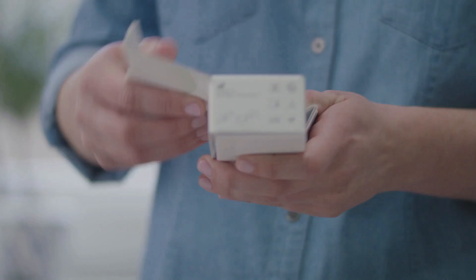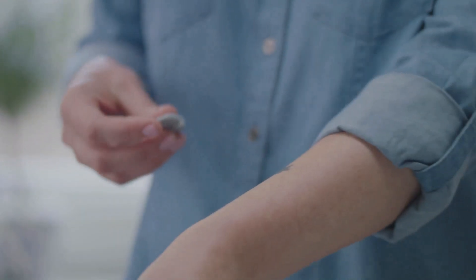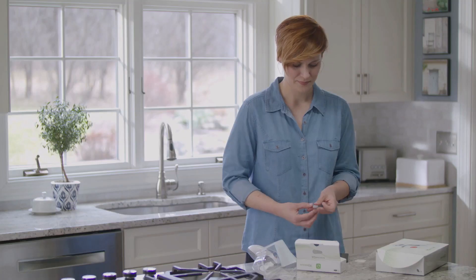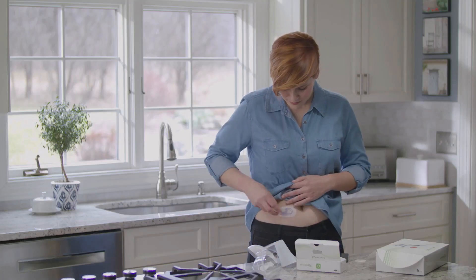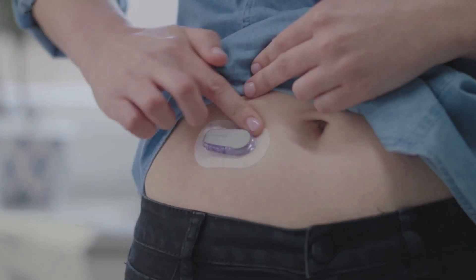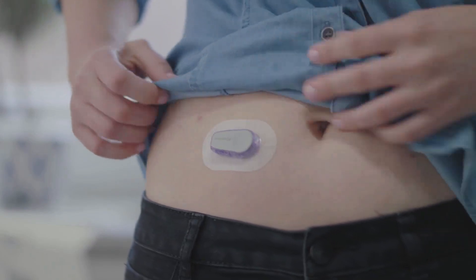You'll wear each sensor for 10 days. Now it's time to attach your transmitter. Take your transmitter out of the box. Clean your transmitter with an alcohol wipe and let it dry. Insert the tab of the transmitter into the slot on the transmitter holder. Snap the transmitter firmly into place. Rub around the patch three times. You've successfully attached your transmitter. You'll reuse the same transmitter for three months. Once your transmitter is attached, you can swim, bathe, and shower like normal.